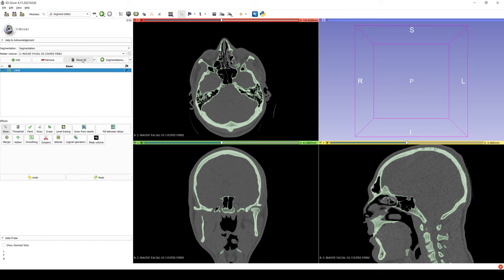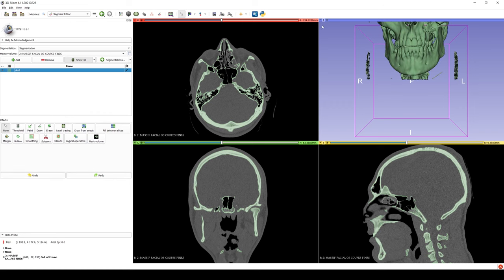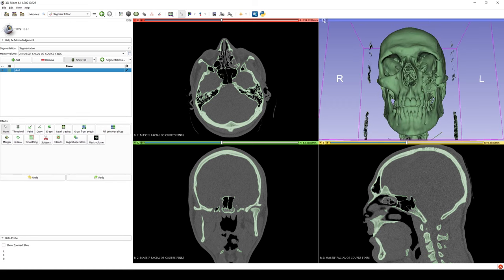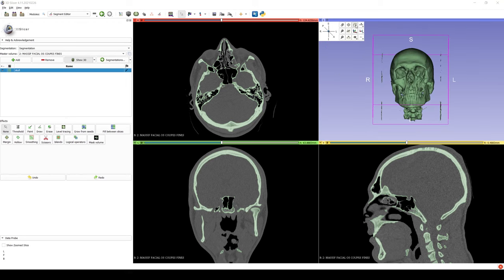In order to show the 3D image, click on the Show 3D button. Then we click on this button in the upper left side of the 3D image to center the image.